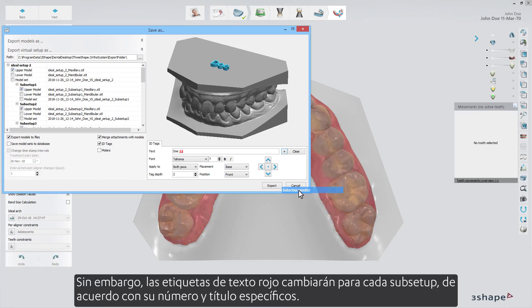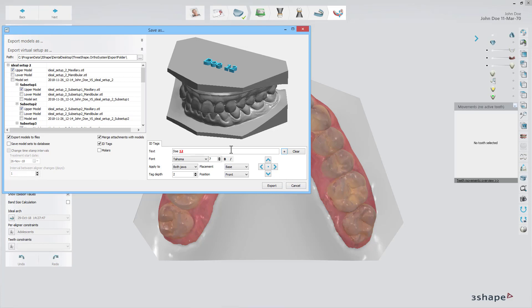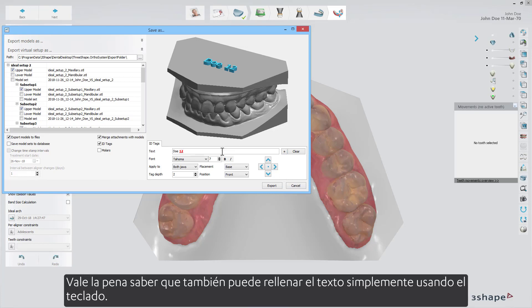However, the red text tags will change for every sub-setup according to its specific number and title. It's worth knowing that you can also fill in the text simply by using your keyboard.